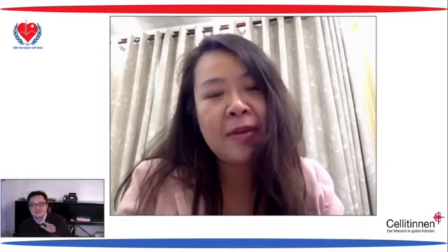And the second question is, when we do full volume, what is the ideal volume rate? I'm not sure about it, but for GE, I think it is 15 frames per second. I'm not sure enough, but I can look. I think it must be 15 frames per second.